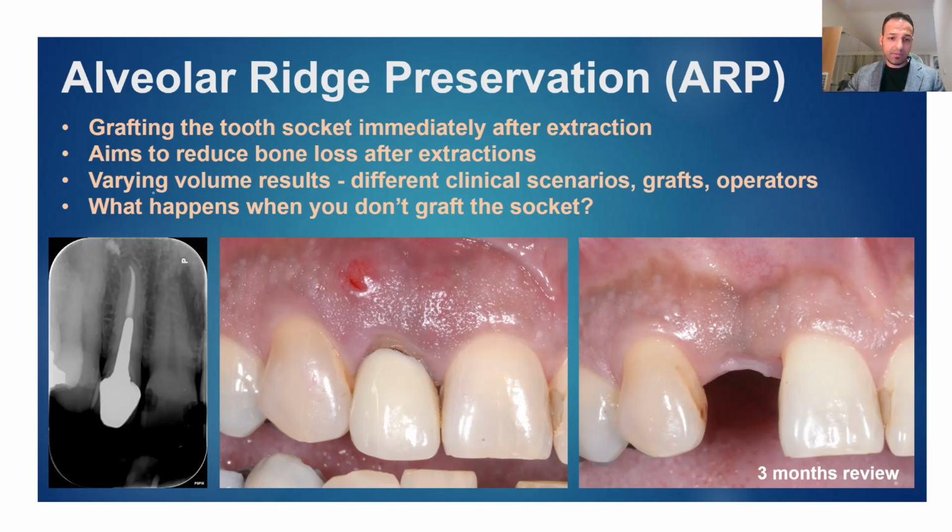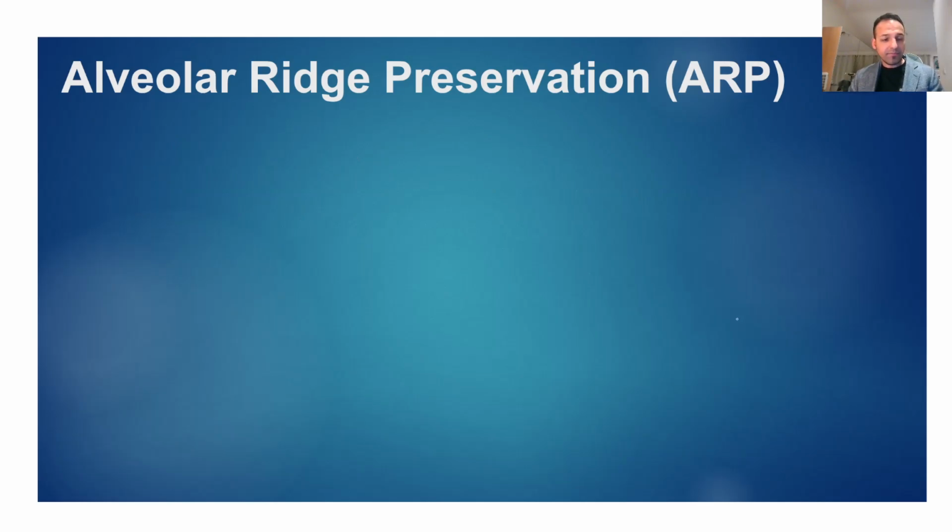As you can see, the pathology opened up with a sinus buccally, and we took the tooth out. We didn't graft in this situation. At 3 months, you can see the complete loss in the outline, both vertically and particularly horizontally. Can you see that defect at the mucogingival junction, where they've lost buccal bone?